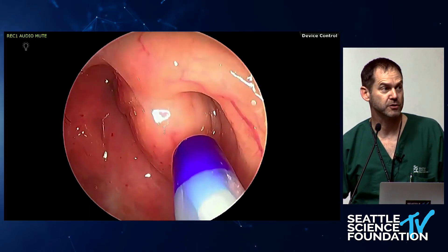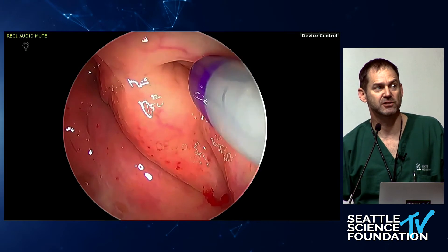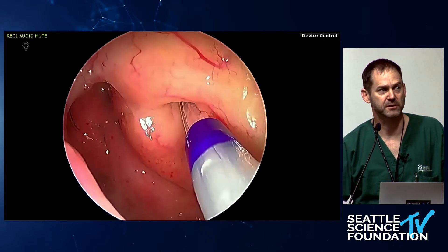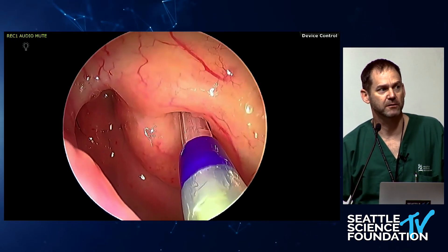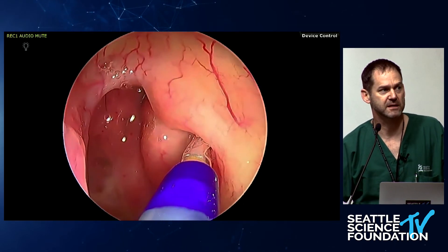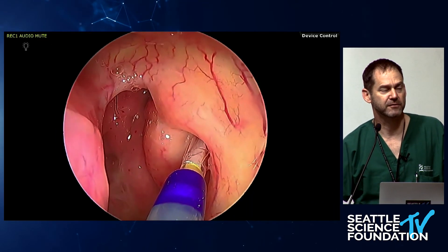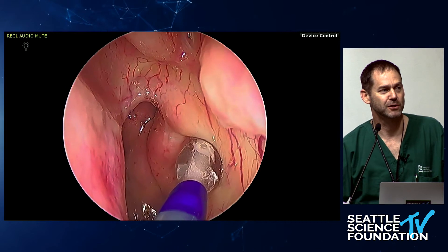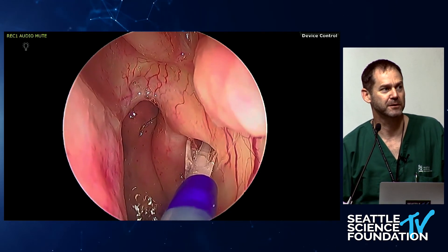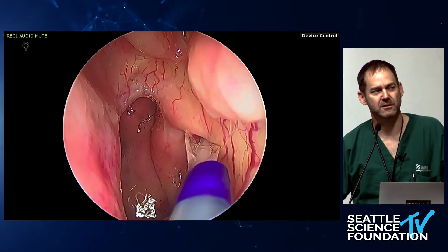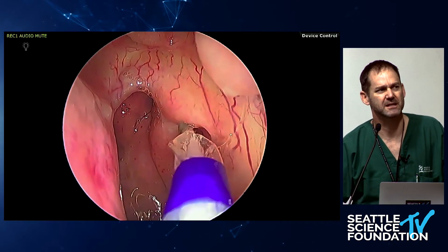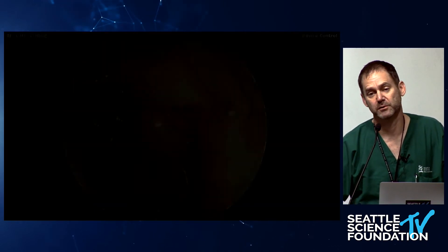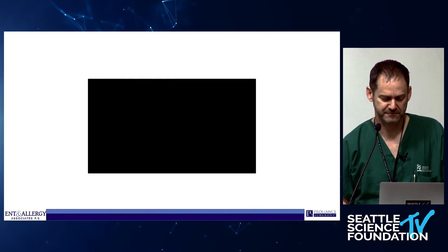Here's a short video showing atraumatic use of the gentle tip to feed it into the eustachian tube. There really should be no resistance while you're doing this. There's a nice band of yellow that you'll see — that's where you know to stop. It doesn't go past the torus tubarius. Inflate for two minutes — you tell jokes to your OR team during that time — then pull it out. There's usually a little blush but there really shouldn't be any significant bleeding. Sometimes fluid will come down, sometimes not.